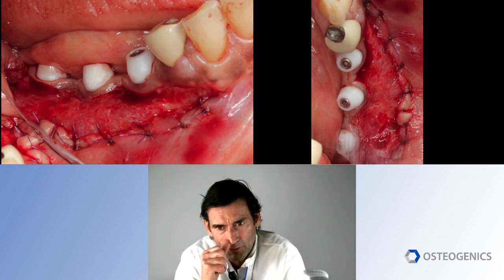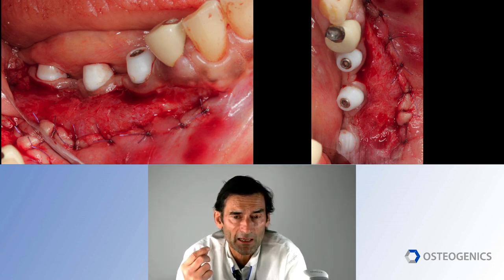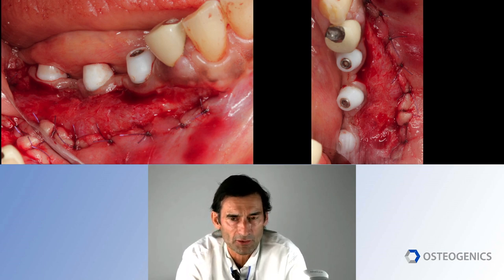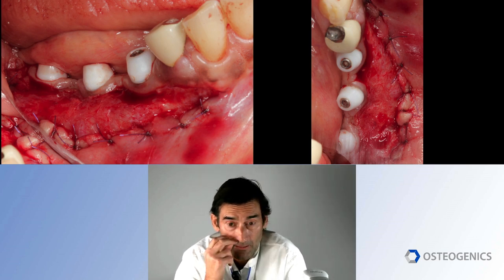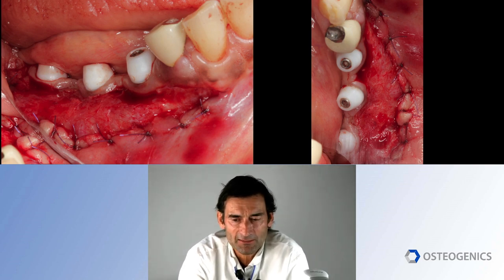Now we go to very unique suture demands. I need a small needle, so I probably will use a 10 millimeter needle here. So I can go to the margin of that flap, which is mucosal, so it's thin, and I can grab some periosteum, which is also thin. And I'm going to reposition that flap margin in the apical direction. So this will probably be a Glycolon 5-0 or 6-0 with a 10 millimeter needle, something in that range. Absolutely not using a PTFE here, and absolutely not using a nylon here, right? So this is only territory for resorbable sutures, and my preferred one here is the Glycolon.